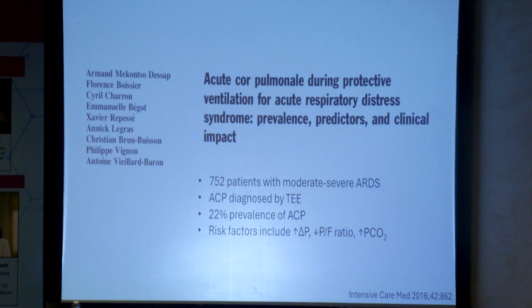About the VPA, you said the indication is acute right heart failure. In the majority of the conditions where we have right heart failure, we have associated severe pulmonary arterial hypertension. So will it be really useful? In pulmonary hypertension, the pressures in the pulmonary circulation are not the major problem. It's whether those pressures lead to the right ventricle failing. So if you can bypass the right ventricle and pump blood into the pulmonary circulation, you should be able to create the flows to overcome the elevated pressures. You're offloading the right ventricle, correct.